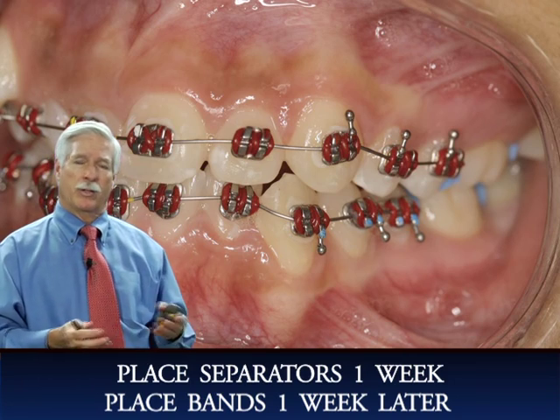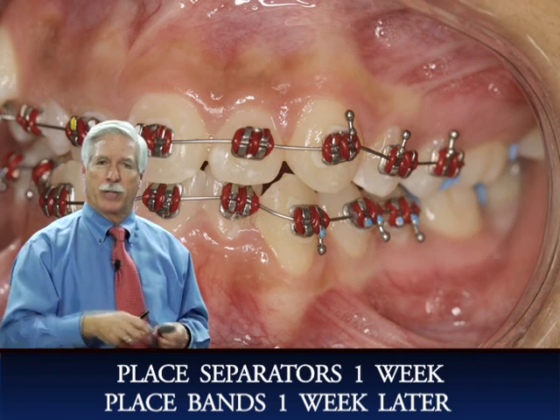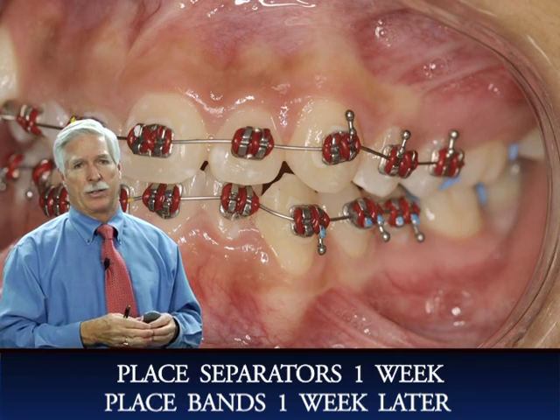As I said, the molar bands are a little more difficult, a little more pushing, a little harder on the patient than putting the little brackets on. Putting brackets on really is a breeze.